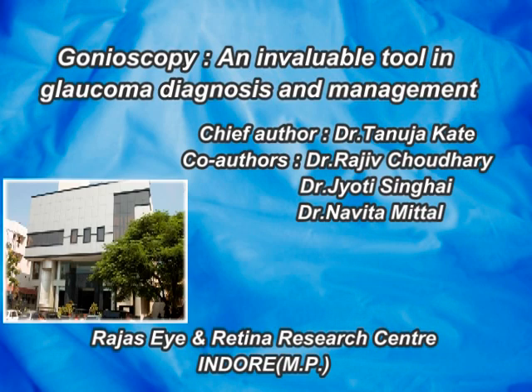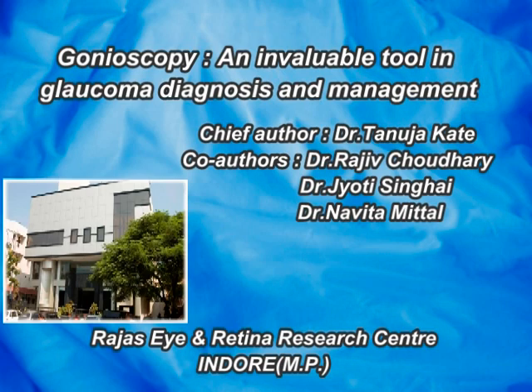Gonioscopy is the biomicroscopic examination of the anterior chamber angle of the eye and it gives clear insight into the pathogenesis of glaucoma. This video shows the technique of performing gonioscopy, identification of different angle structures, and the gonioscopic findings in commonly encountered scenarios.